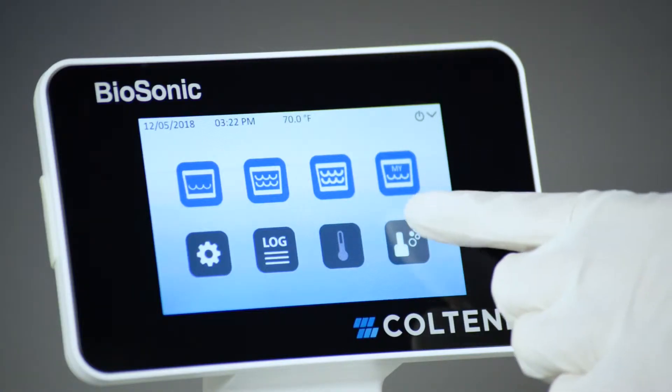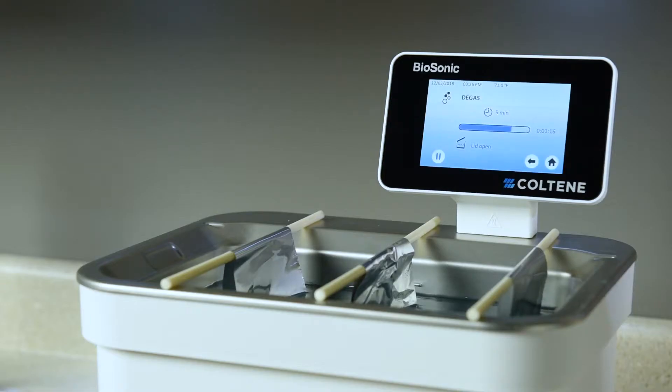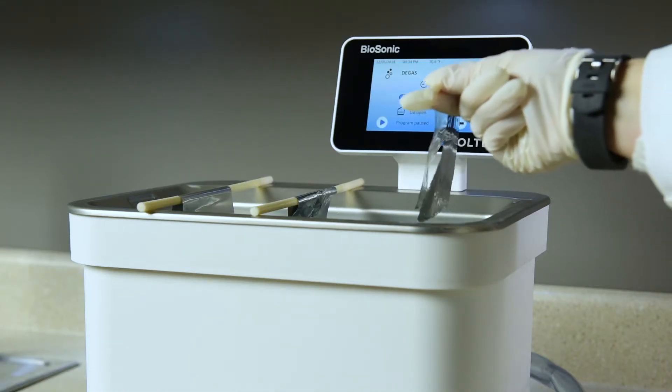Then, run your UC150 for a 5-minute cycle with the lid off. When the 5-minute cycle is complete, remove the foil test strips and inspect them.